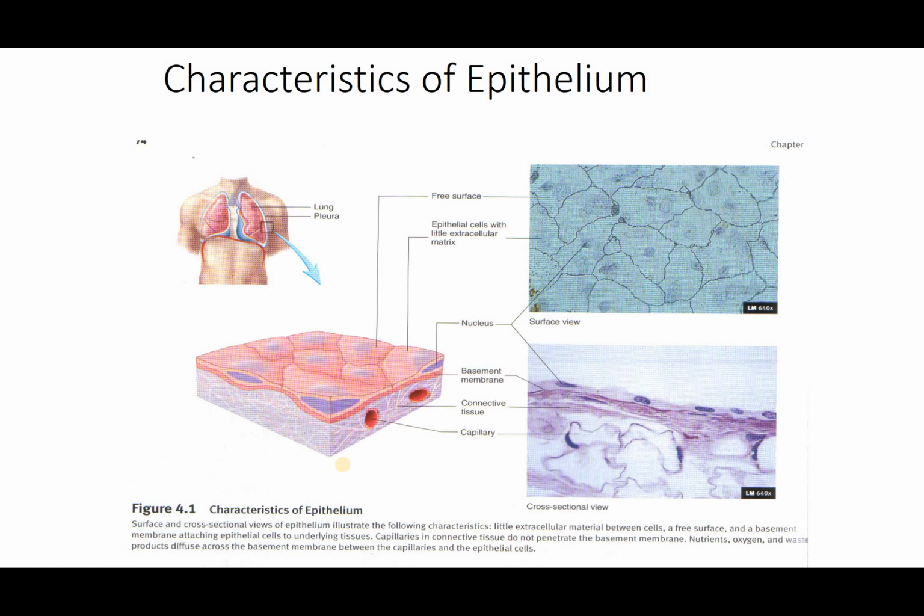Okay, this one we're looking at a section of the lung. This is simple squamous epithelial tissue, and simple means one cell layer thin, so we're dealing with one cell layer, and it's squamous, has that fish scale look to it, and because it's thin, this will be responsible for diffusion. As you can imagine, in the lungs, gases diffuse very easily across this type of tissue.